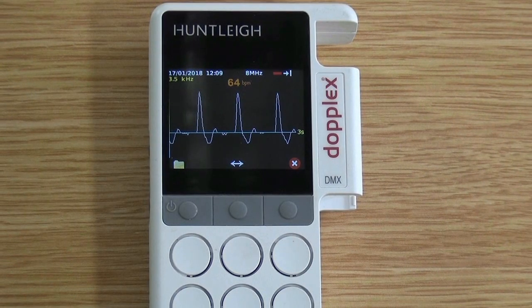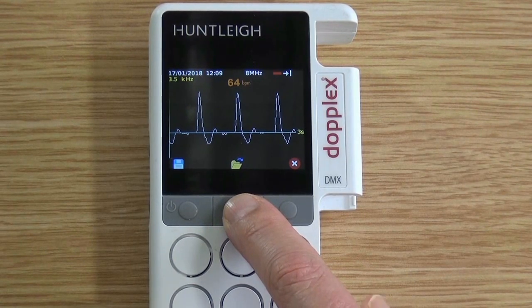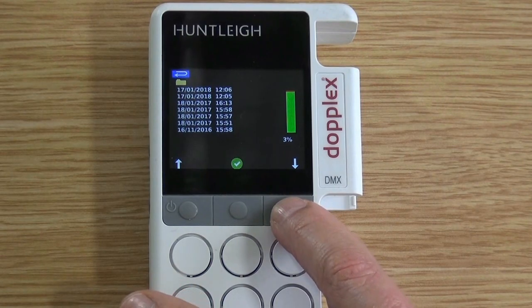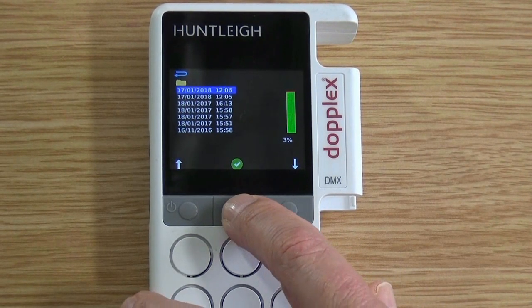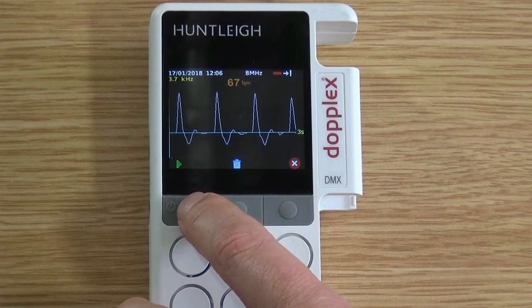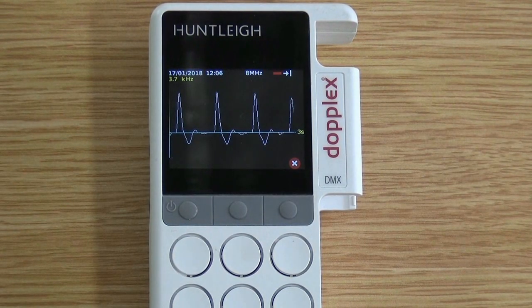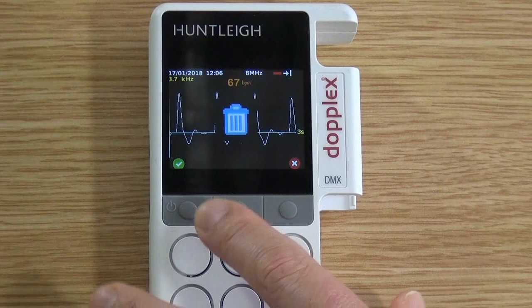To replay recorded traces from the memory card, press the file menu key and then button 2. This opens the folder where you can see a list of previously stored waveforms in a date and time format. Press the left button twice as shown. To replay any of these, press the down arrow button and then press the green tick — the waveform and sound will play. To play again, press button 1. If you wish to delete a waveform, press the middle button and the dustbin icon will show on the screen, then press green tick and the waveform will be deleted.